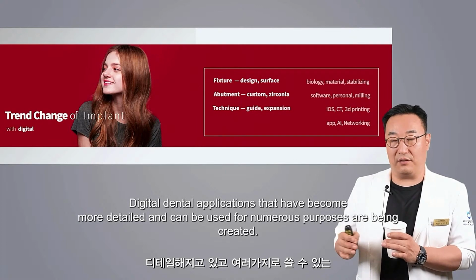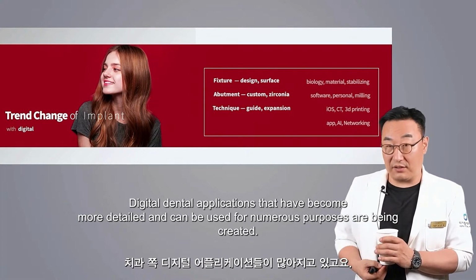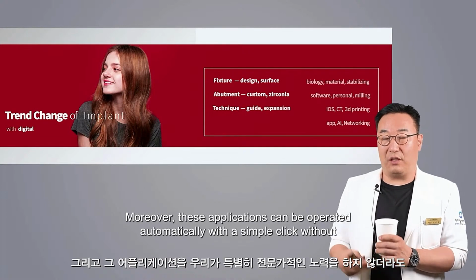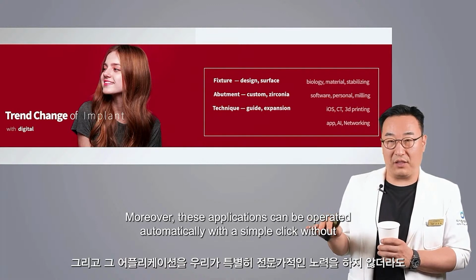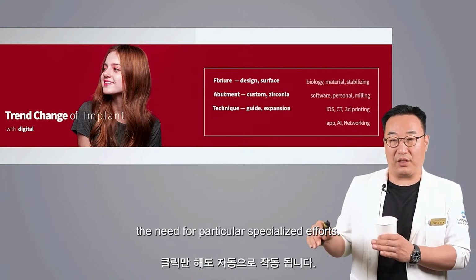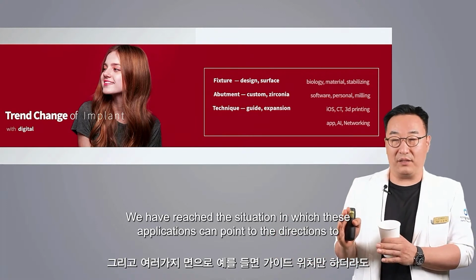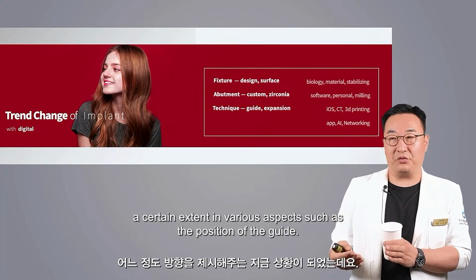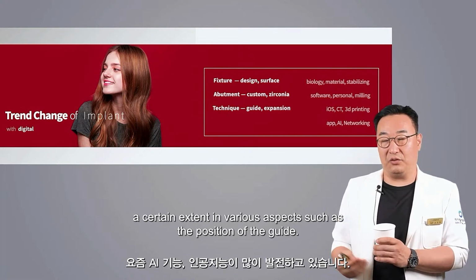Digital dental applications that have become more detailed and can be used for numerous purposes are being created. Moreover, these applications can be operated automatically, with a simple click, without the need for particular specialized efforts. We have reached the situation in which these applications can point to the directions to a certain extent in various aspects, such as the position of the guide.